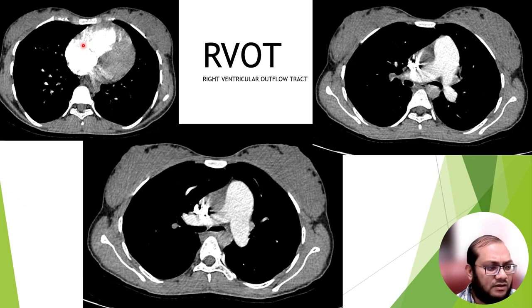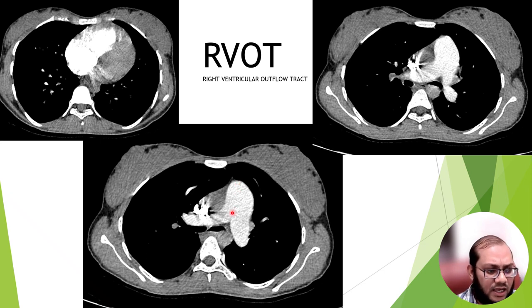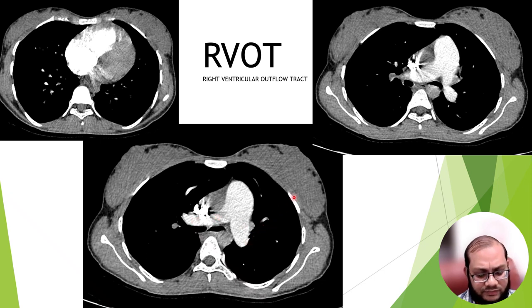Here we can see on the CT axial images: blood from the superior and inferior vena cava enters into the right atrium, and from the right atrium it goes into the right ventricle. The main pulmonary artery arises from the right ventricle and divides into a longer right pulmonary artery and a shorter left pulmonary artery. The ductus arteriosus in adults becomes fibrous and is called the ligamentum arteriosum.